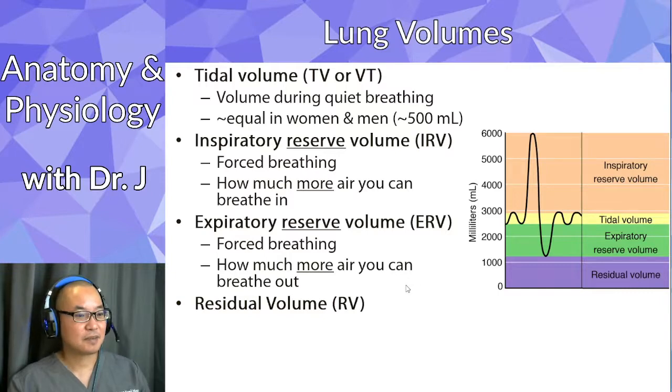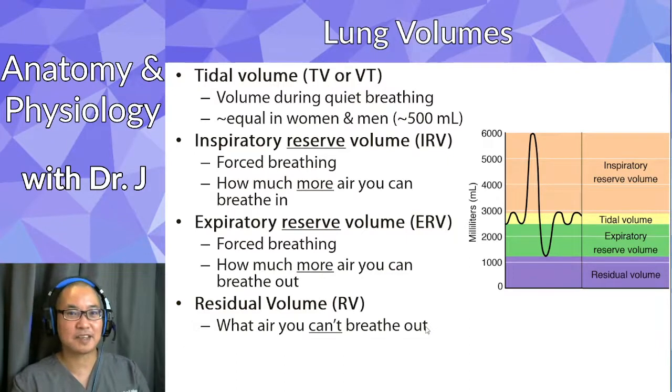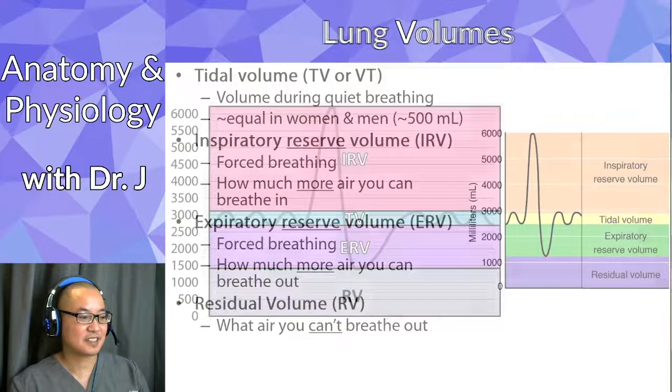So spirometers cannot measure residual volume because you can't collapse your lungs. So again, it's the air you can't breathe out. You breathe out as much as you can, but say you have coffee and there are little coffee stains and coffee grounds on the bottom of your cup. It's the residue, right? Just like residual volume, coffee grounds are the stuff that's left over. Residual volume is the stuff left over after you try to exhale as much as you can.